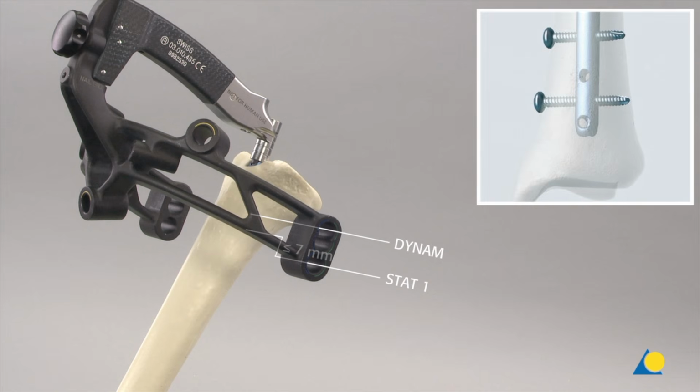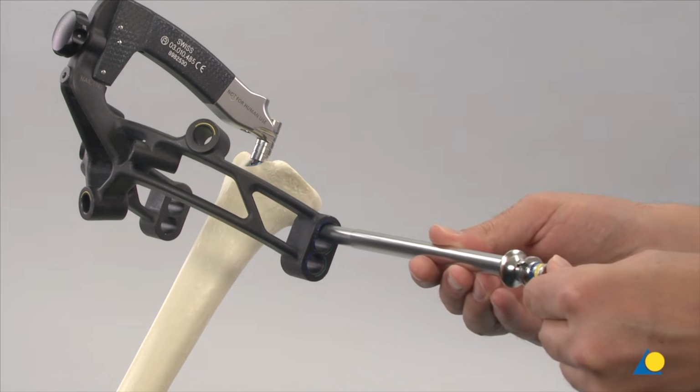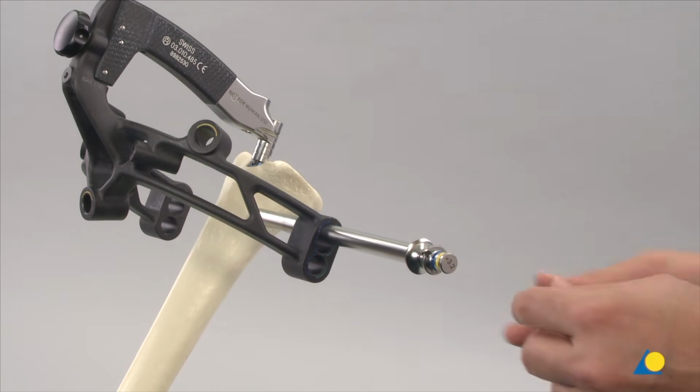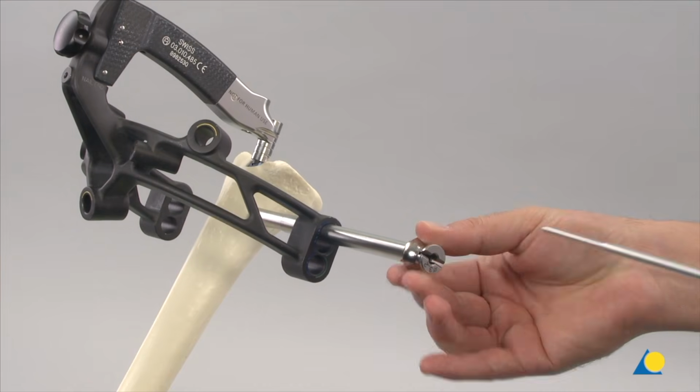It should be noted that distal locking is required prior to compression locking. The three-part trocar combination is assembled and inserted through the hole marked Dynam on the aiming arm through a stab incision down to the surface of the bone. The trocar is removed.